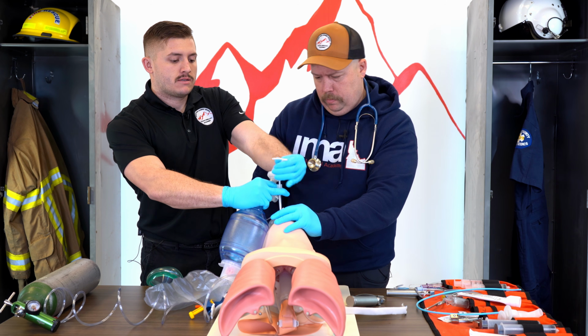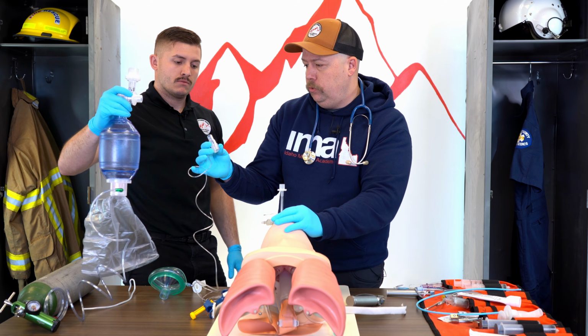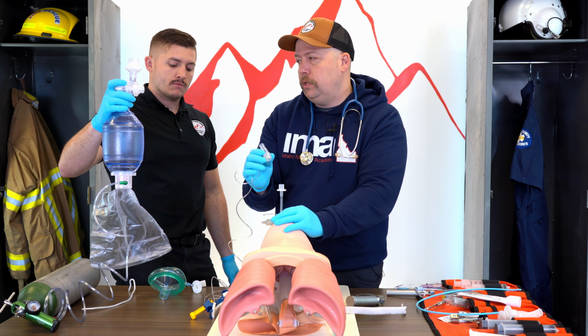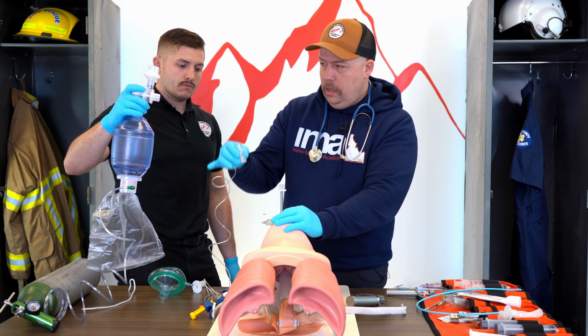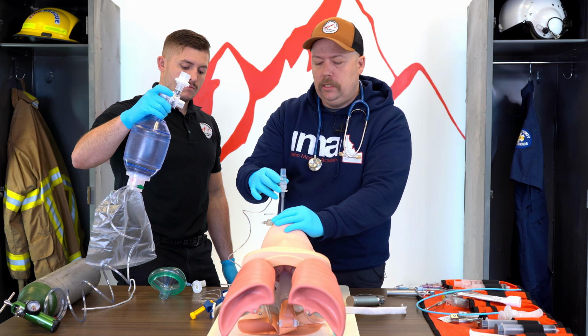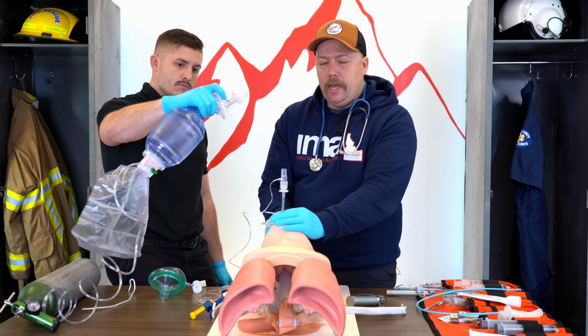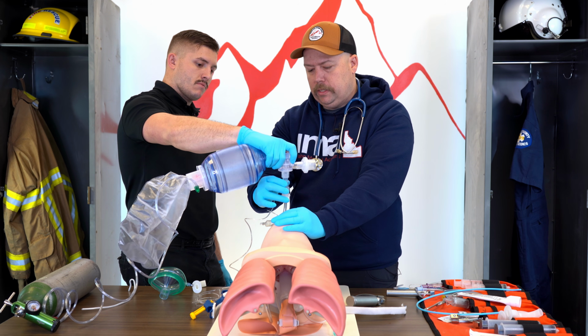Next, we're going to place an end-tidal CO2. This is going to be an inline end-tidal CO2. It's something else that you might have ready, and your partner might ask you to put it on. This is going to go between the BVM and the ET tube. And so this is measuring end-tidal CO2. You don't need to worry at the basic level too much about that. Go ahead, yeah, you can go ahead and place it.